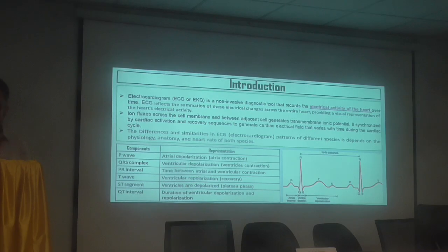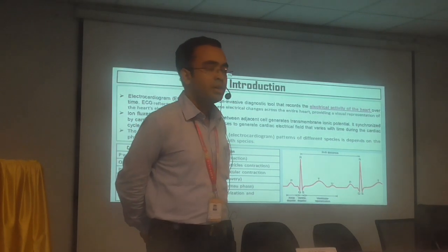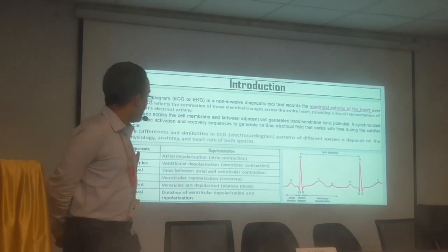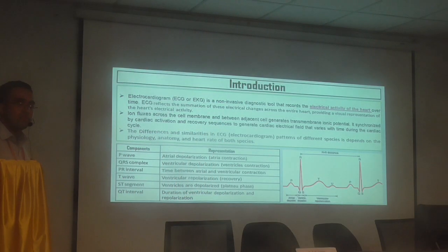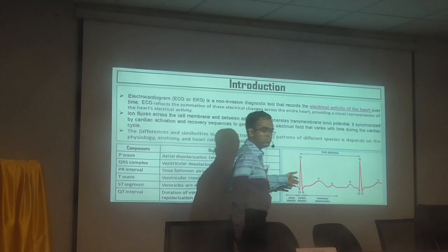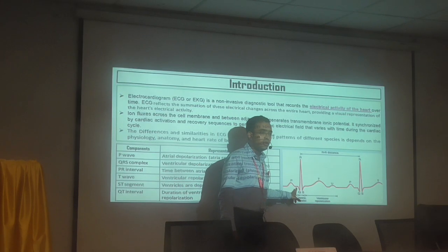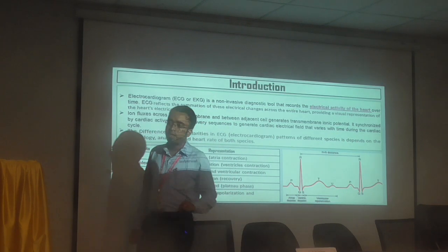Okay. So yesterday, Somnath sir beautifully discussed various parts of ECG, ECG interpretations, and the ECG graph. First, I go to the general introduction of the ECG graph. That is the ECG graph. So that is the P wave, QRS complex, and another one is the T wave, right?